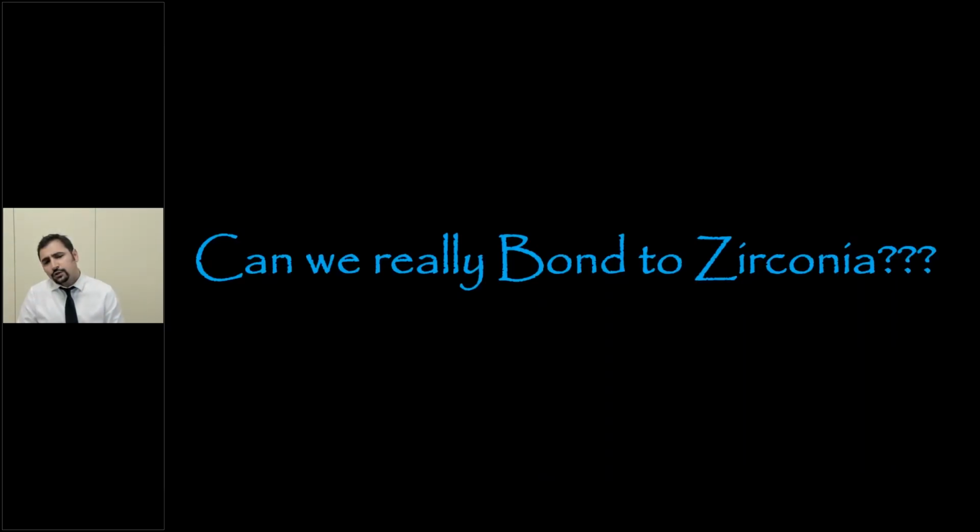Now, there's always this question: can it really bond to zirconia? Essentially that comes from the fact that with lithium disilicate, we know as a fact that glassy ceramics like lithium disilicate, we can simply use hydrofluoric acid to make them rough and then use a resin cement to bond them really well, and they really work. We have known this as a fact for many years.